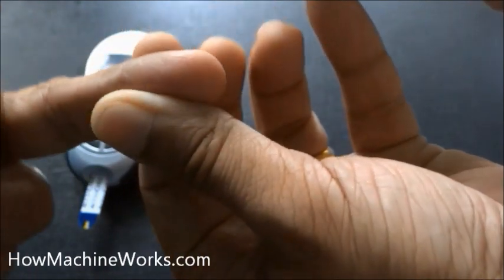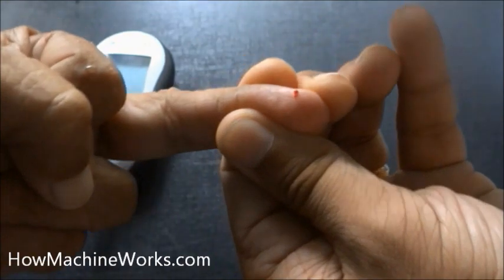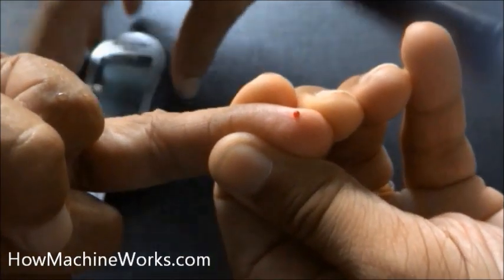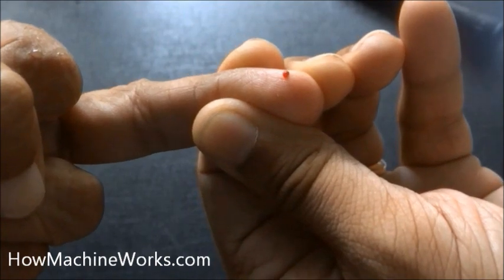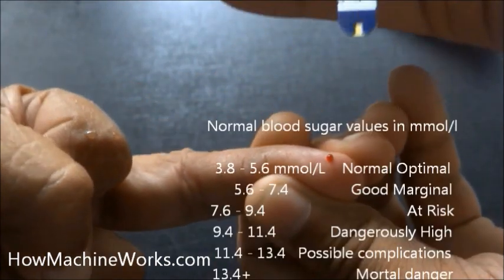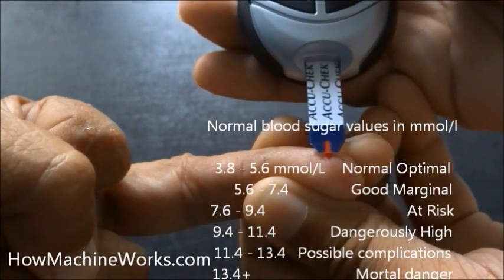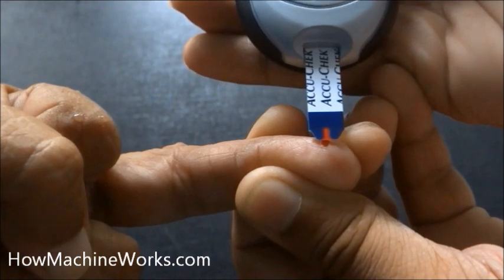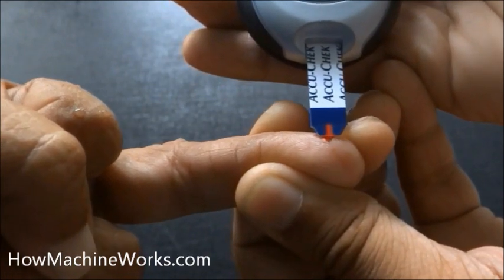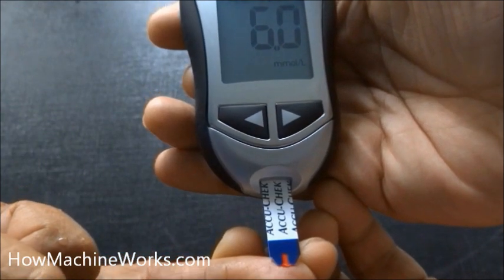Use the finger to check — the blood is coming out, which is enough for it to function. Now put the test strip with the yellow portion towards the blood. It normally takes about five seconds. You can wait until the countdown reduces back and a beep sound occurs, then you'll get the reading. In an empty stomach in the morning, a reading of six is good — it's in the marginal good level.